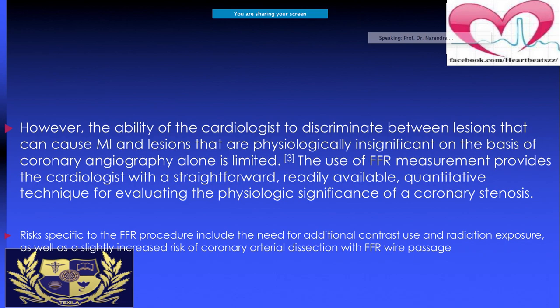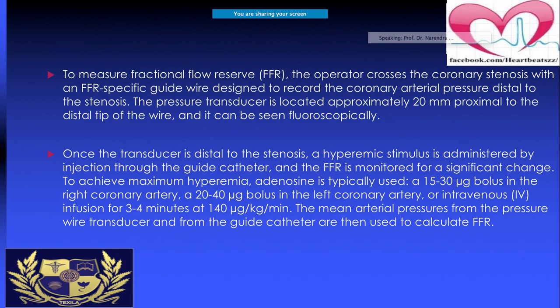You know, for that you may need additional contrast use, radiation exposure, or even there's a slightly increased risk of coronary artery dissection with the FFR wire passage itself. So you also need to be a little bit careful, not just take the pressure wire and say, okay, let's do the FFR.